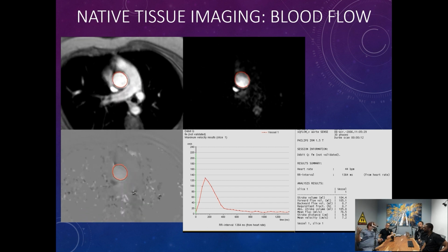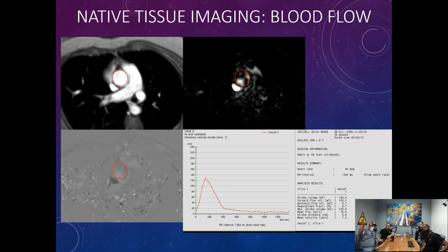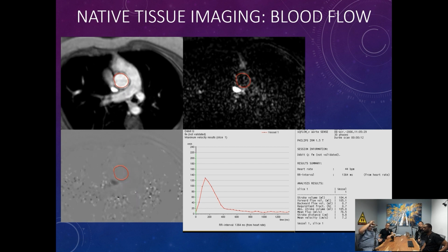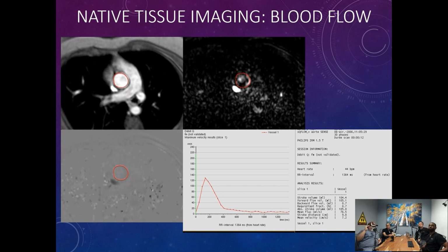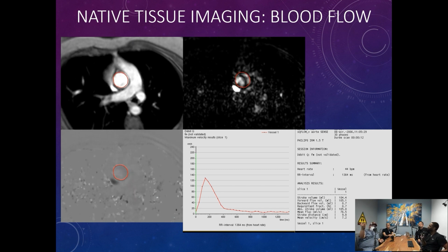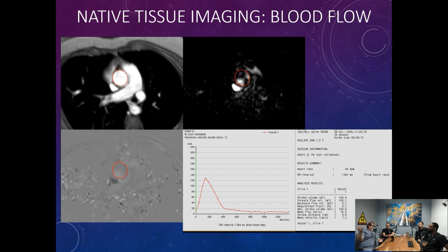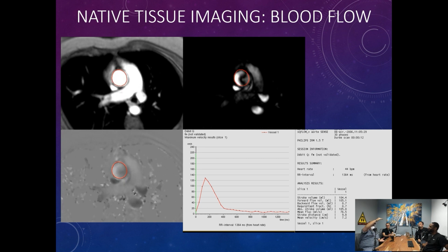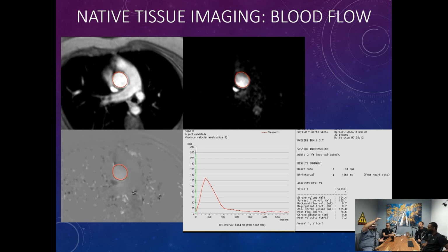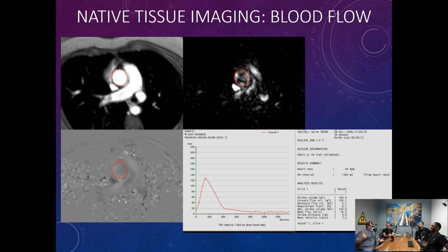And so analogous to a color Doppler on echo, basically when we're imaging using this technique, we have to decide what velocities we want to look at going in. And if our velocity scale isn't set properly, if it's not broad enough, what happens is if you have some protons that are moving faster than your velocity scale, the scanner doesn't know where to put that signal because it ran out of space, right? So, if you're set at 200 centimeters per second as your top and it's going 250, there's no 250. It doesn't know what to do. So it wraps it around and sticks it at the bottom. Now that is an immensely oversimplified explanation.